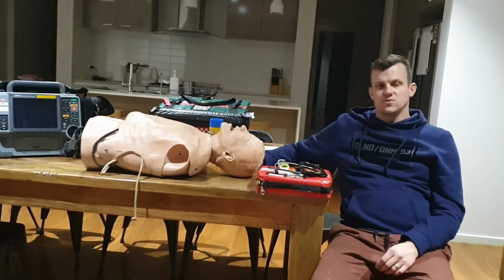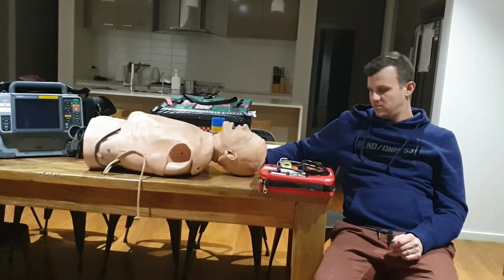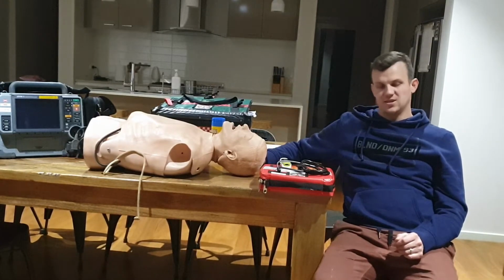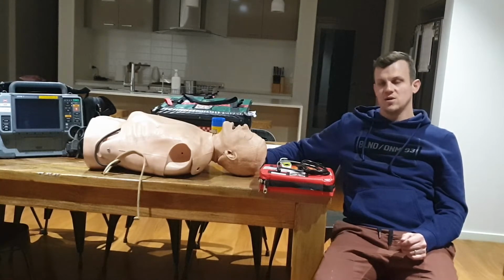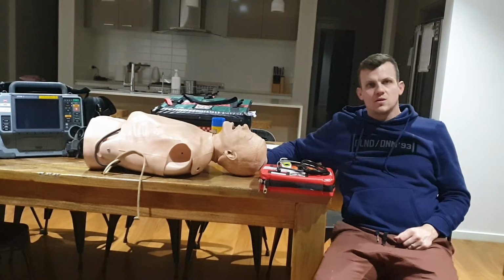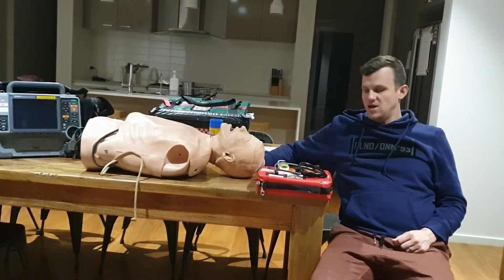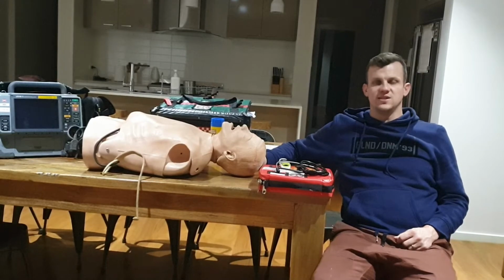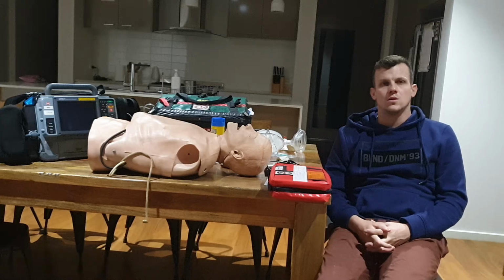So indications for synchronized cardioversion are rapid ventricular rate accompanied by severely compromised cardiac output. These include pulsatile VT, supraventricular tachycardia, atrial fibrillation, and atrial flutter. The contraindications associated with synchronized cardioversion are VF, pulseless VT, and patients with dysrhythmias with adequate cardiac perfusion.